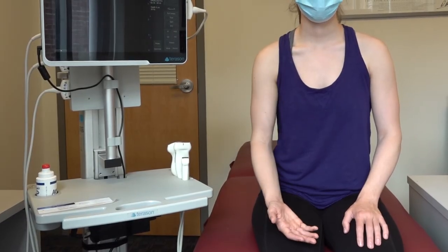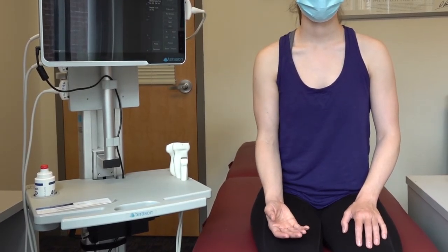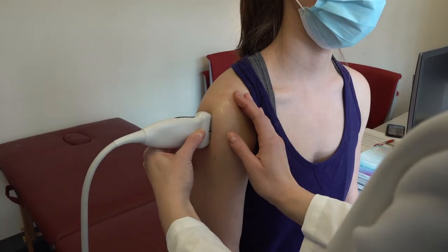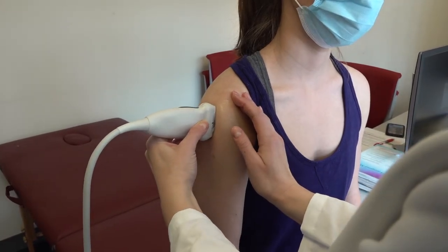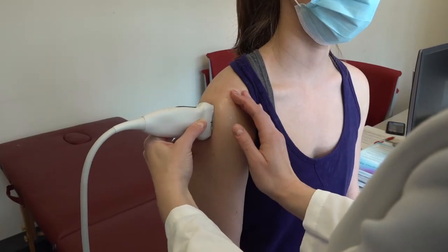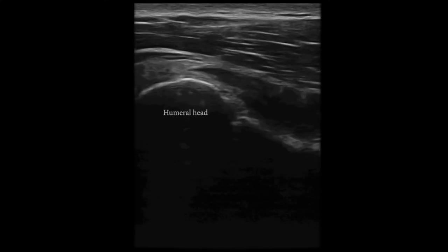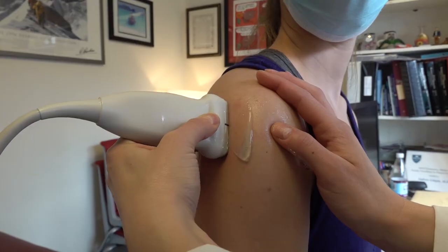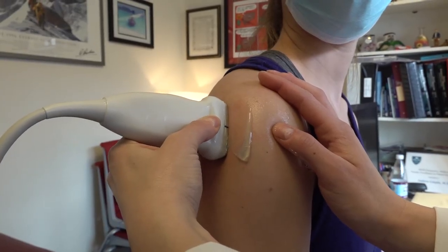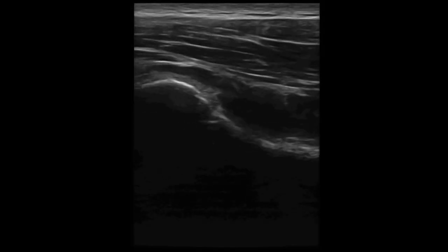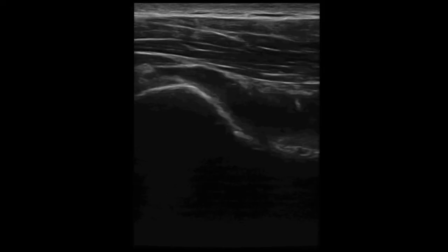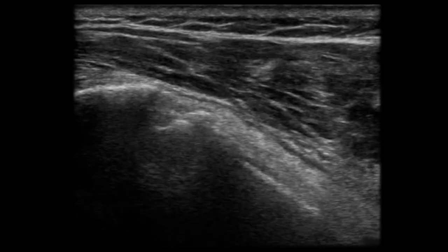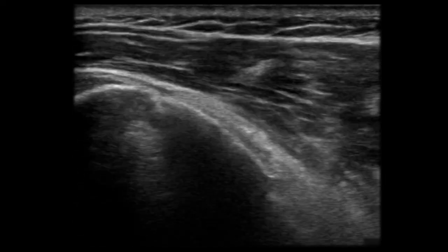Have the patient rest the symptomatic forearm in a position of comfort. Place the probe with the marker oriented cephalad on the lateral margin of the proximal humerus. Locate the humeral head, which should appear light bulb shaped with even contours. With special attention to sites of tenderness, fan through the head of the humerus to evaluate for cortical disruption or overlying hematoma, which may suggest the presence of a fracture.